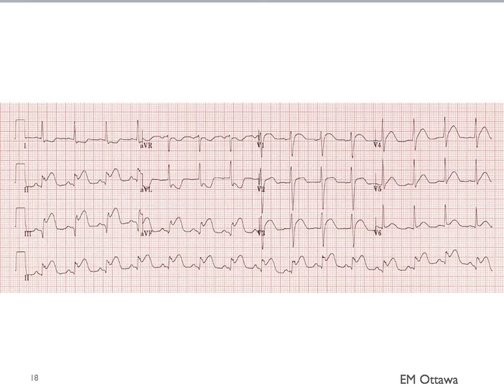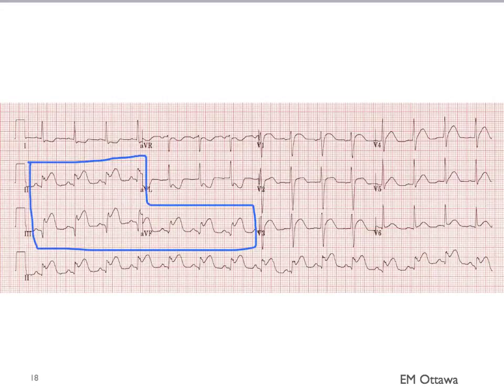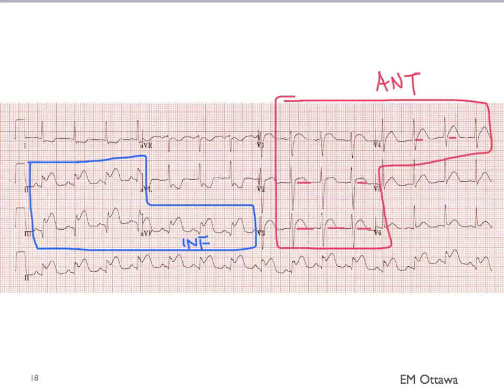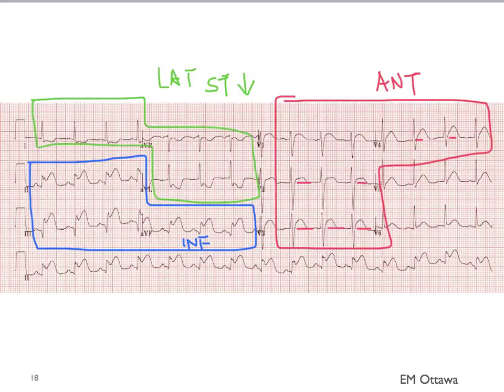Let's try this one. The ST elevations are in the inferior leads and some in the anterior leads. Where are the ST depressions? We expect them in the lateral leads since the inferior part reciprocates with the lateral. There are some in leads 1 and AVL. Therefore, you can explain all the EKG changes with an antero-inferior ST elevation MI with reciprocal changes in the lateral leads.